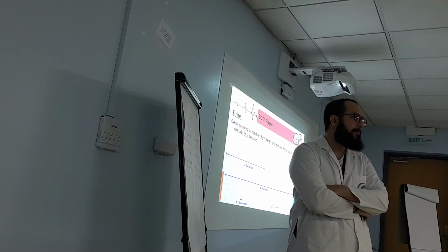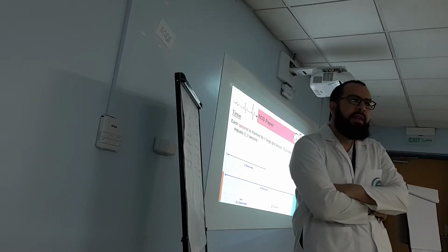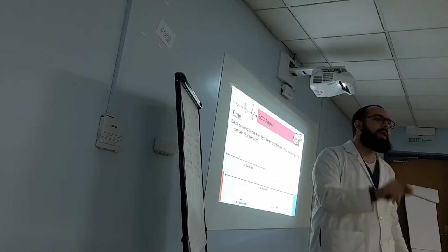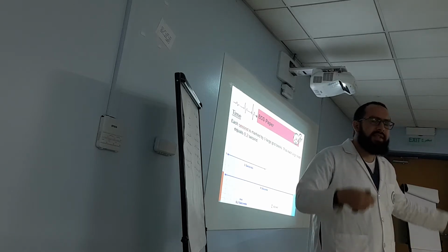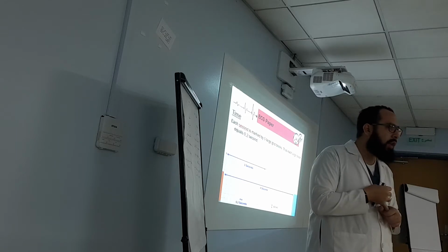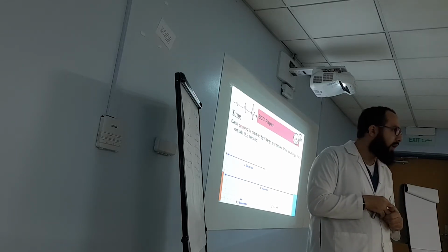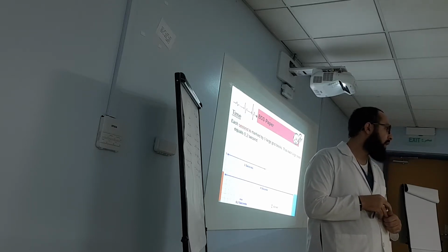How much? 1,500. So if you turn on the machine and let it run for 1 minute, then stop, it will print out 60 seconds of time equal to 300 large squares or 1,500 small squares. Okay?